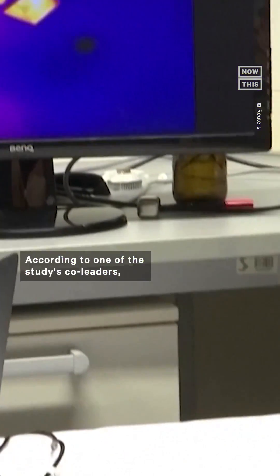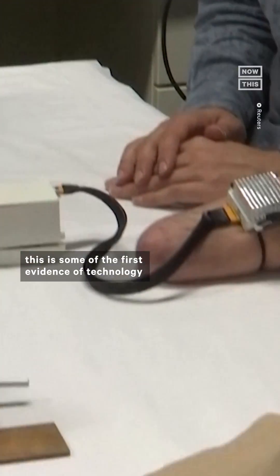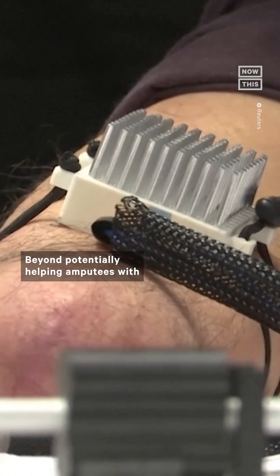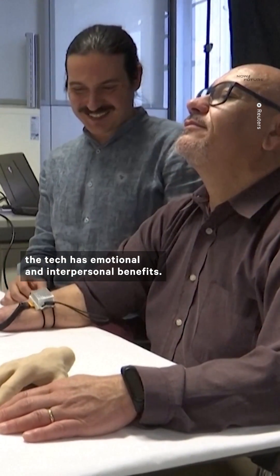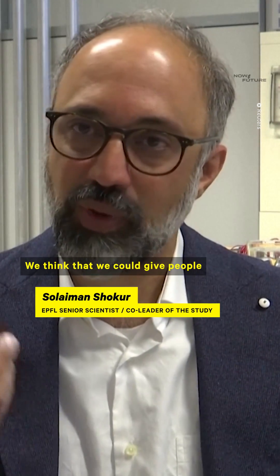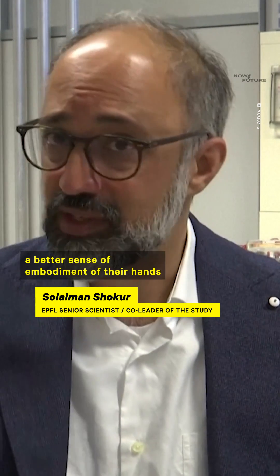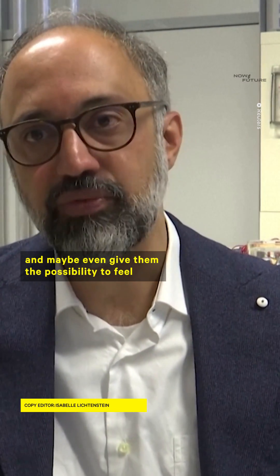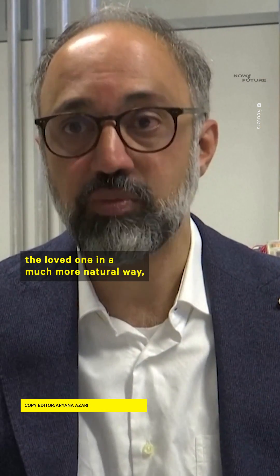According to one of the study's co-leaders, this is some of the first evidence of technology recreating the sensation of temperature on phantom limbs. Beyond potentially helping amputees with daily tasks such as cooking or showering, the tech has emotional and interpersonal benefits. We think that we could give people a better sense of embodiment of their hands, and maybe even give them the possibility to feel their loved one in a much more natural way.